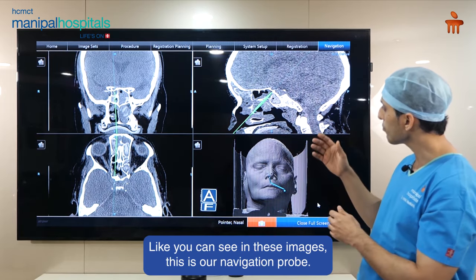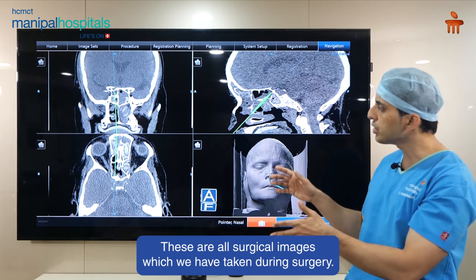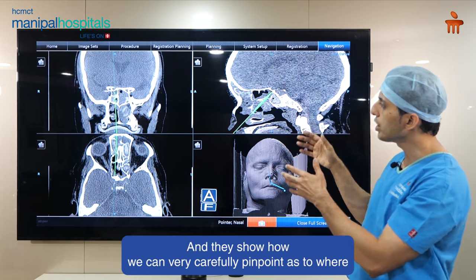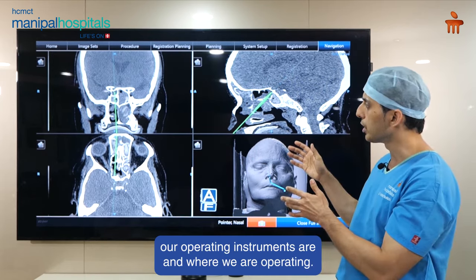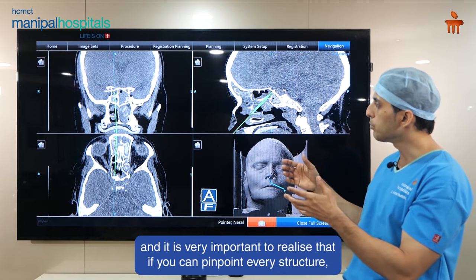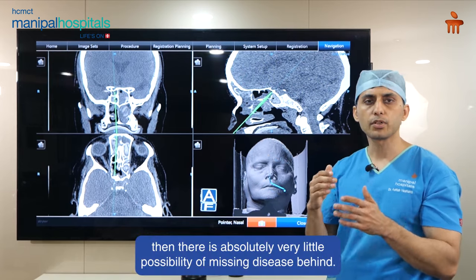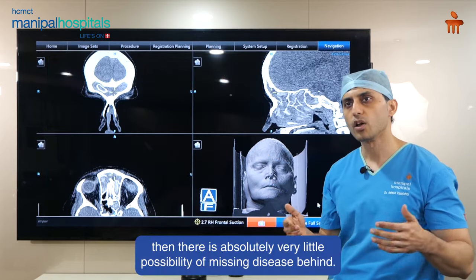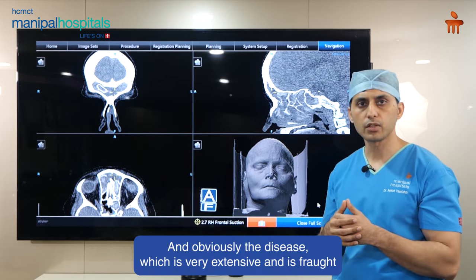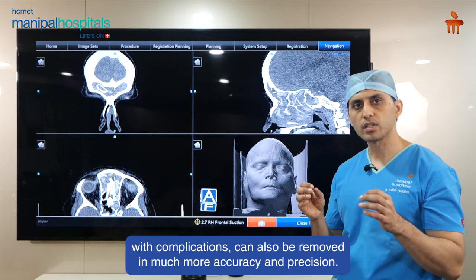As you can see in these images, this is our navigation probe. These are all surgical images taken during surgery and they show how we can very carefully pinpoint where our operating instruments are and where we are operating. All these are very important skull base structures, and it is very important to realize that if you can pinpoint every structure, there is very little possibility of missing disease behind, and the disease which is very extensive can also be removed with much more accuracy and precision.